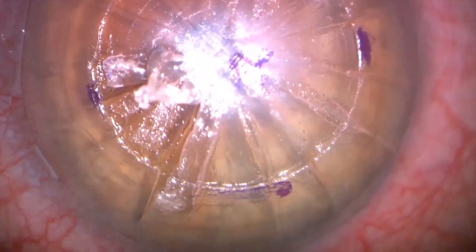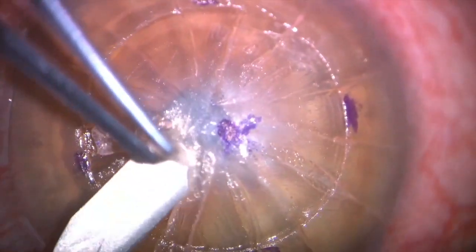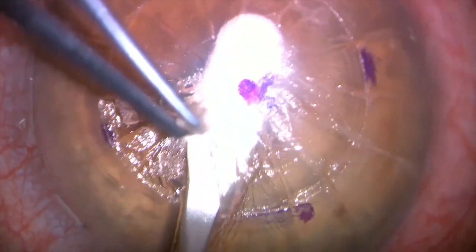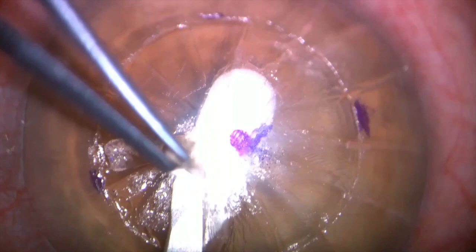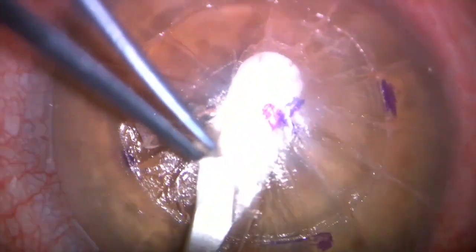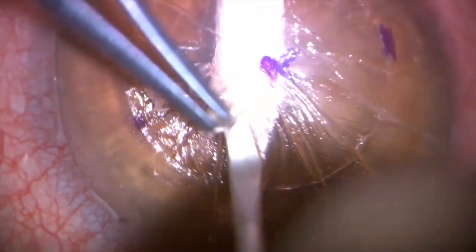See the incisions here in high magnification — open, very deep, and criss-crossing. I have to be very careful because there is danger both anteriorly, where anything can just split open, and posteriorly, where I can literally go inside the eye if I make any mistake of using wrong pressure or being in the wrong plane.